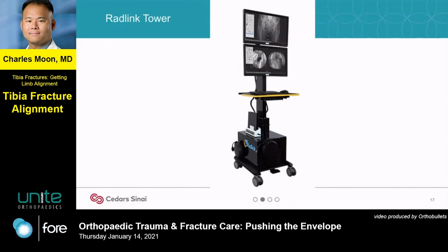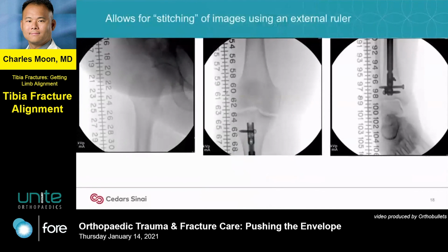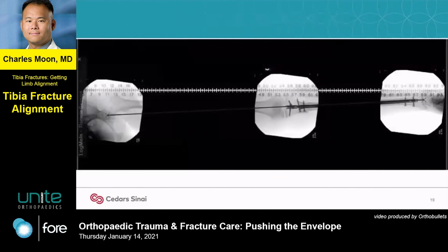But initially, it was something they came up with for limb length and alignment for arthroplasty cases. And, you know, we were listening to them at the various grand rounds and M&Ms and whatnot, and looking at this and going, huh, can we steal this? So we stole it. And this is what it does and what it looks like. And then you get this. So it's a way to create a perfect limb alignment. Now, of course, if the limb alignment isn't perfect on the other side, this doesn't help you very much, but at least you can get a perfectly anatomic hip to ankle axis.